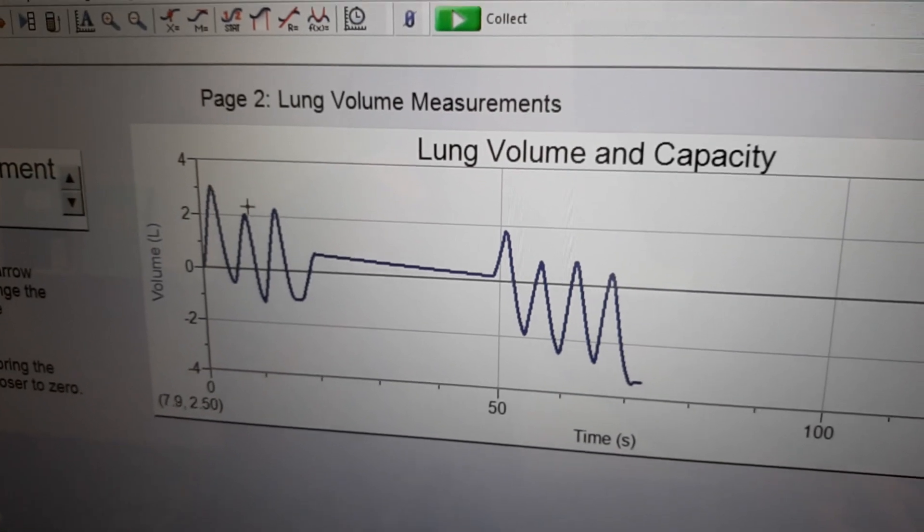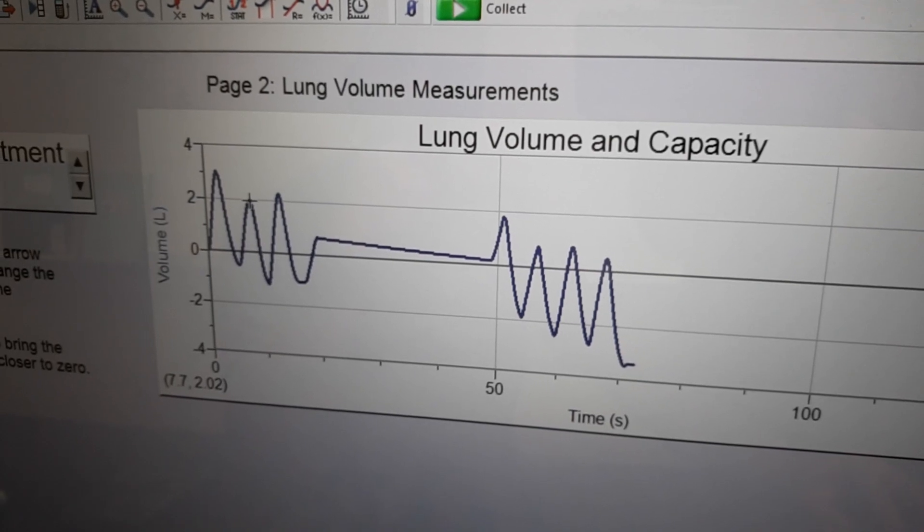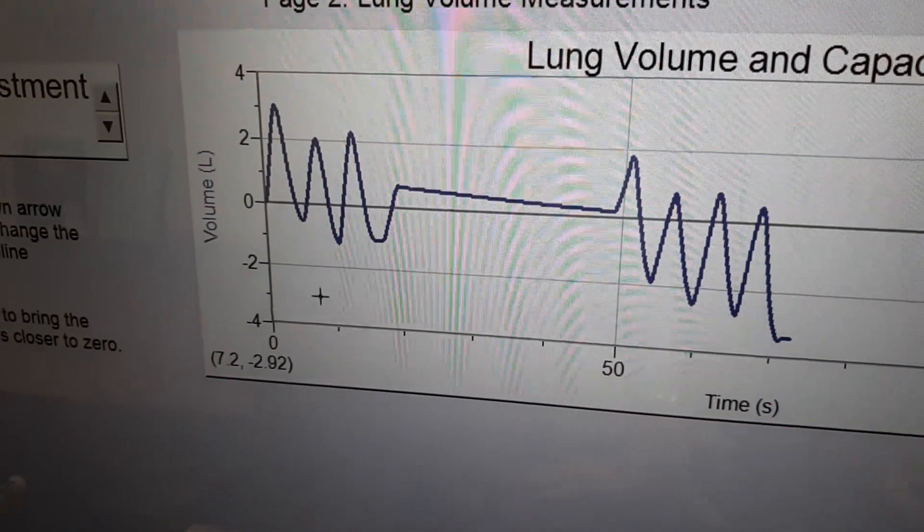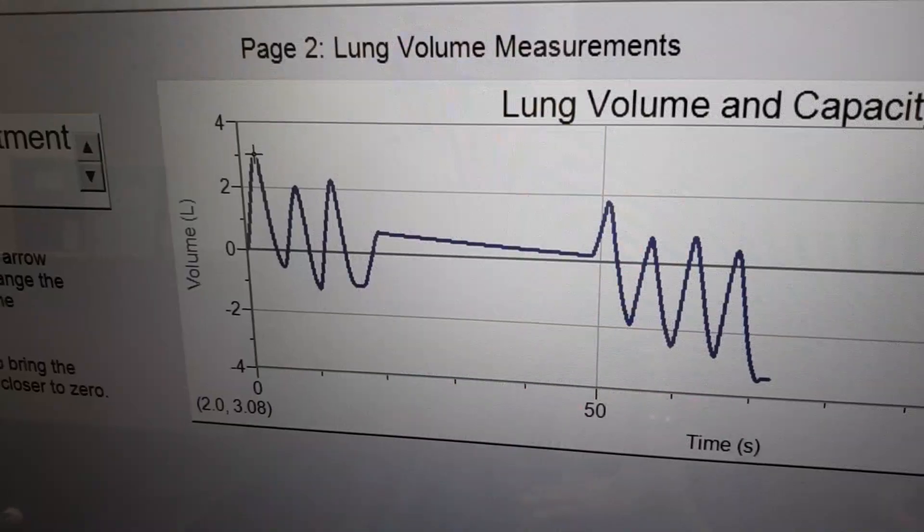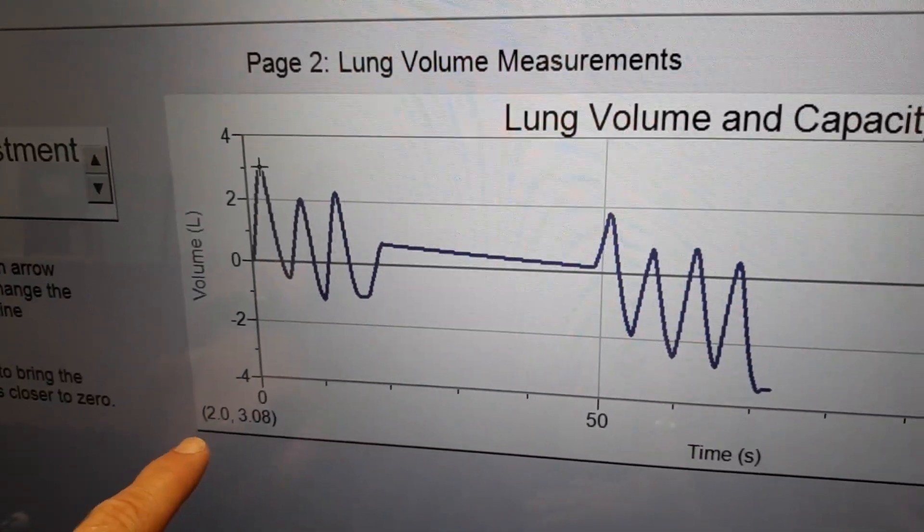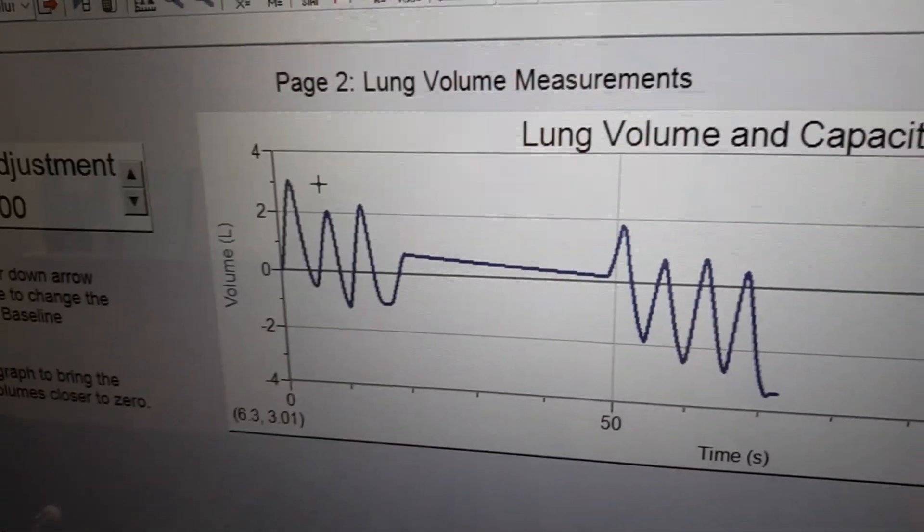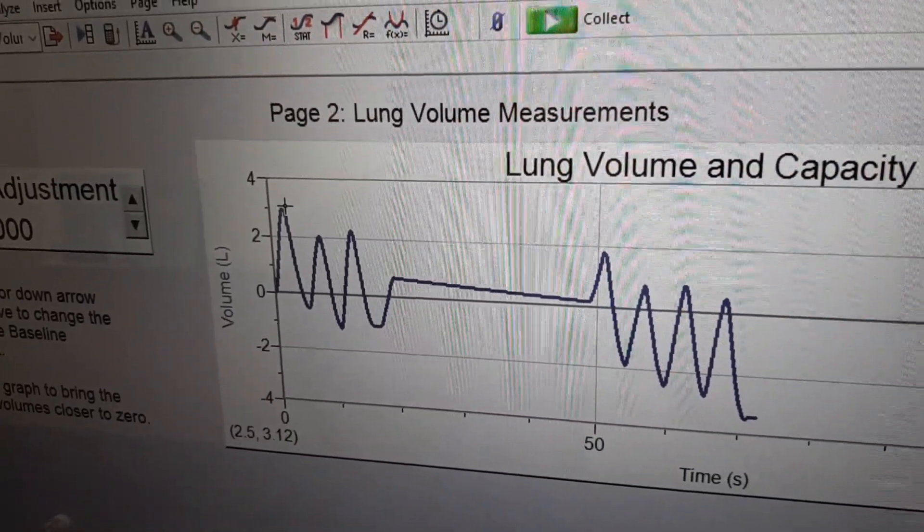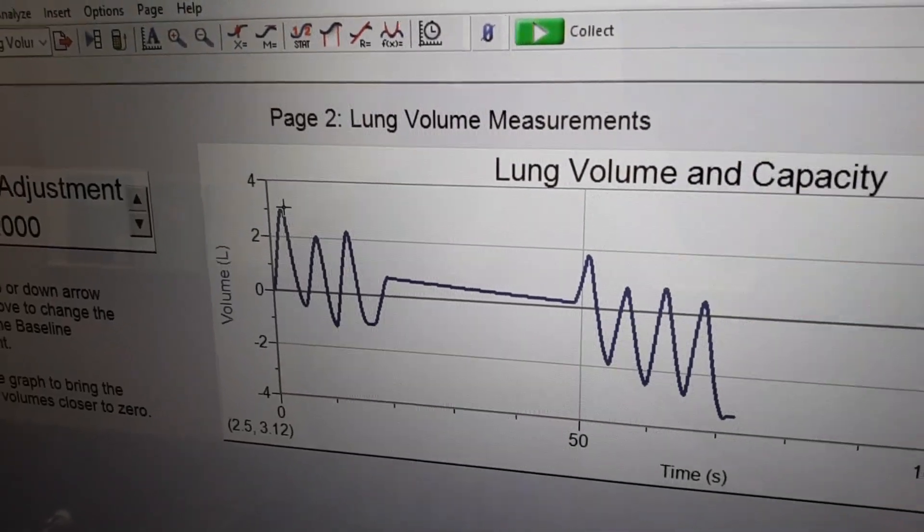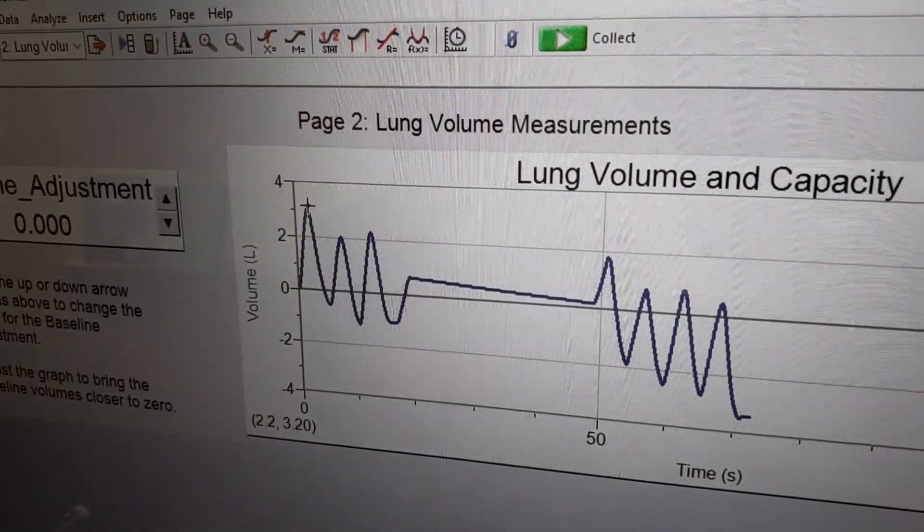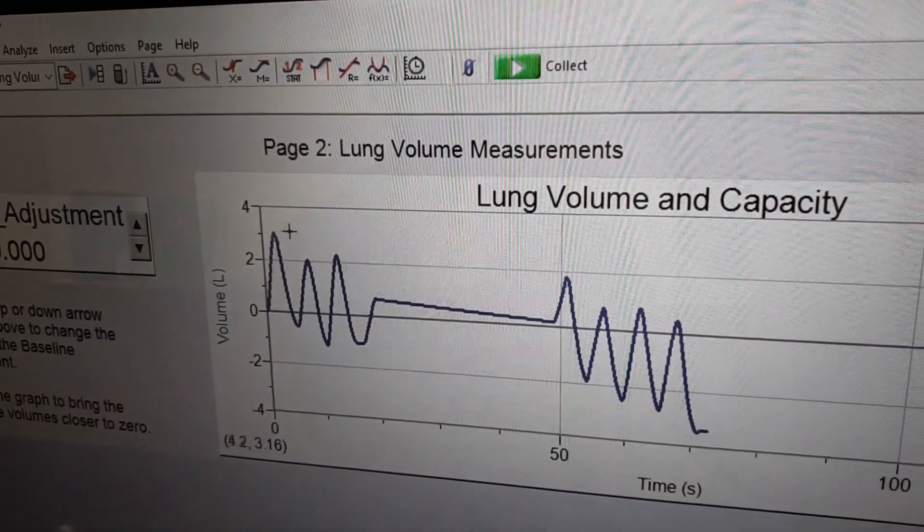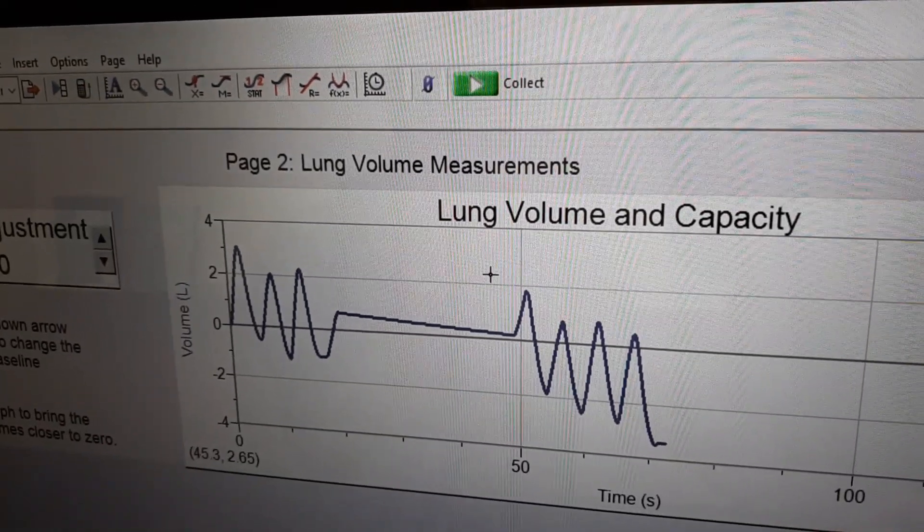Then if you move over on your data sheet you will be asked to find the time of the second peak so if we go over to your second peak put the mouse there we've got 7.7 that correlates or corresponds excuse me with 7.7 seconds and then go to your first peak and this corresponds with two seconds so we're going to take the difference between these two peaks and that gives us the length of time for one breath and then you'll record that. At the last column, ultimately the difference between these two you'll divide into 60 and that will give you your number of breaths per minute.